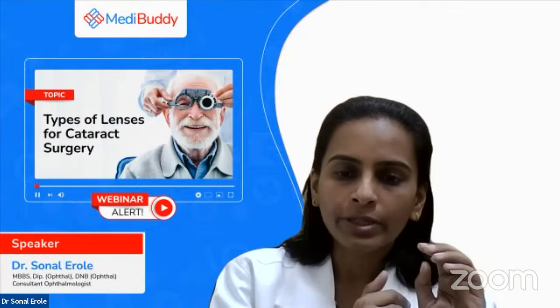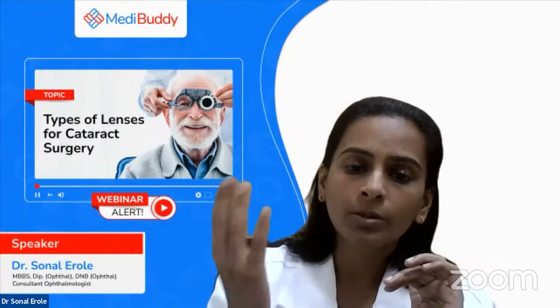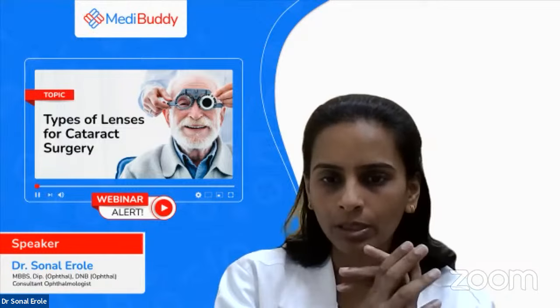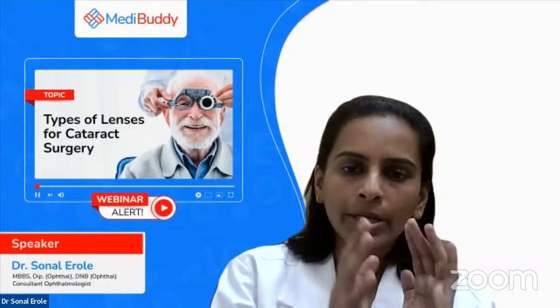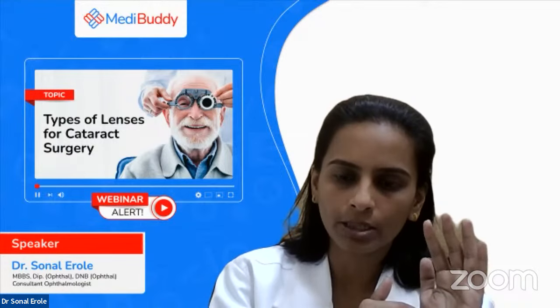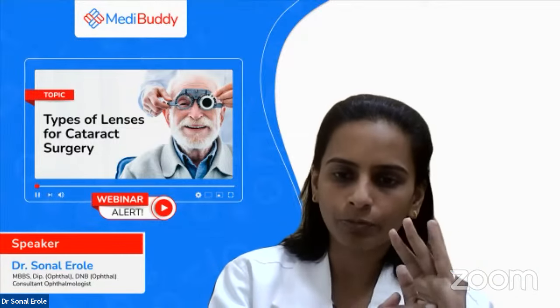If they go for multifocal lenses, they may not have as good vision as other people who do not have diabetes or any problem in their eye. These patients are then not happy that they have put in the multifocal lens and still do not have good vision. Basically, the problem with their vision is because of their retinal problem, not the cataract surgery. So for these patients, we advise them not to go for the advanced lenses if possible.